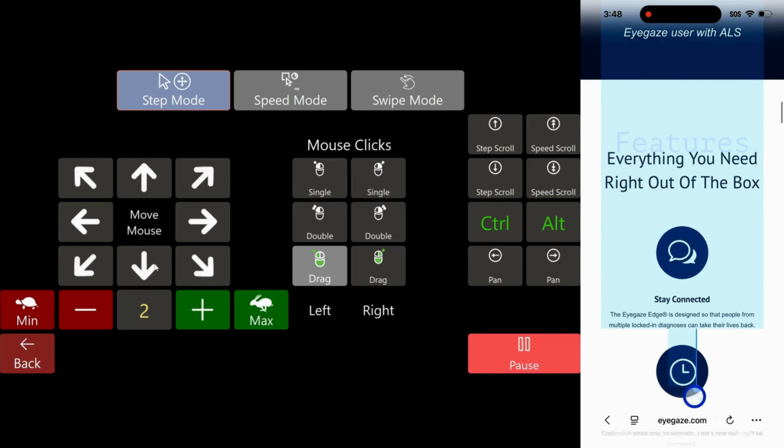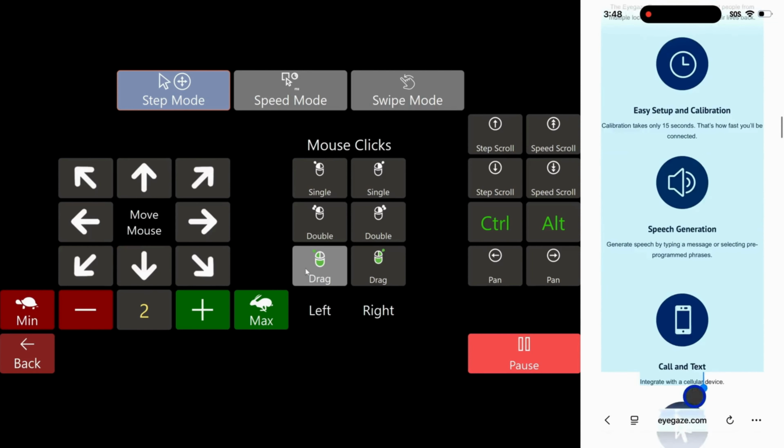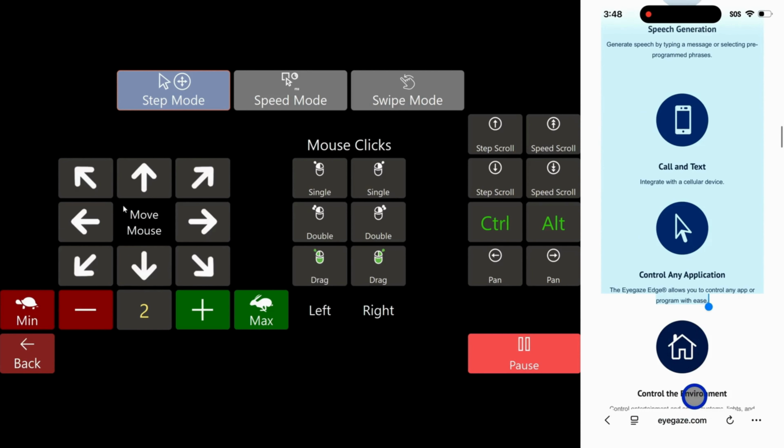Please note, there may be situations where a drag to scroll may not work. In those cases, you can use swipe or step to scroll. Different scroll methods are better suited for different situations. After reviewing these various methods, you can try them out and determine which one works best for your scenario.